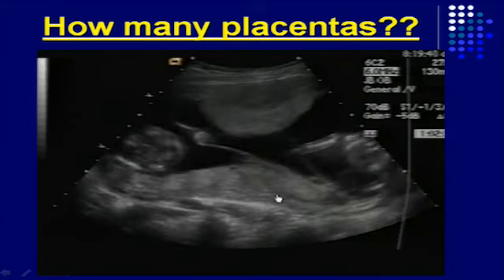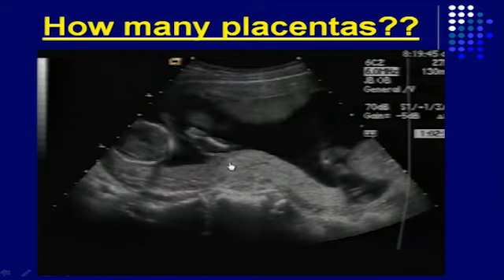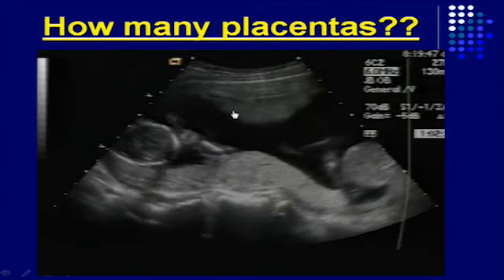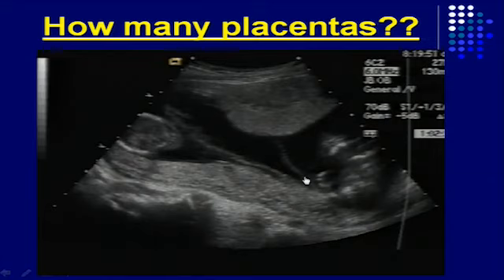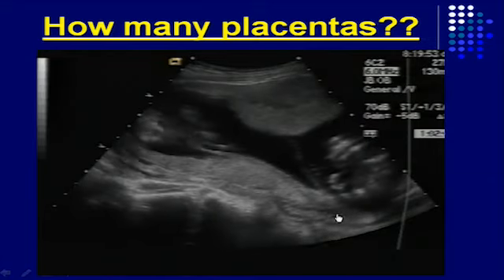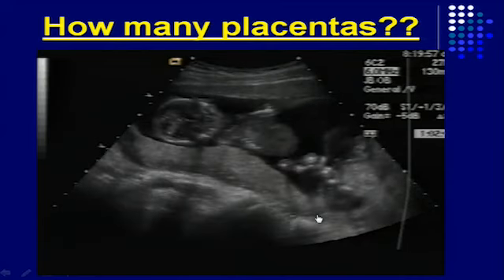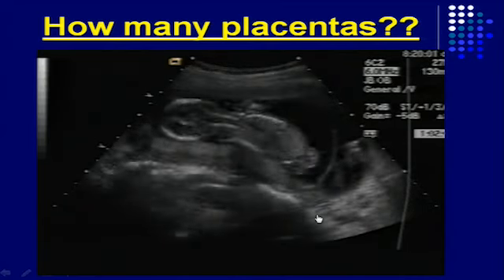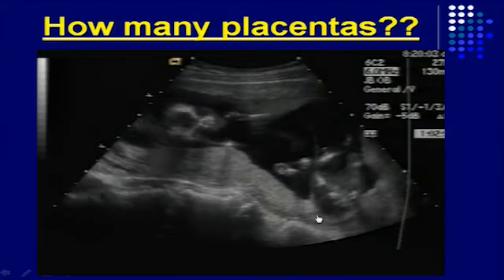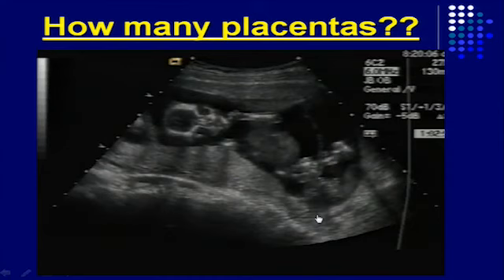Okay, and we're trying to look just for the membranes. So you had 2 posterior placentas. There's that lambda sign, and we had a placenta up here. So there's a head, there's a body, and then there's the one in the middle. Do you see that? So again, just taking time. You have to take time looking, but you're surveying through. So this is a trichorionic, triamniotic, triplet gestation. Look at the baby waving at you at the end.